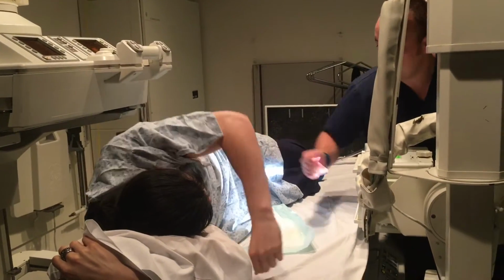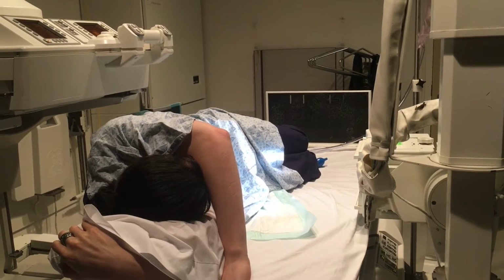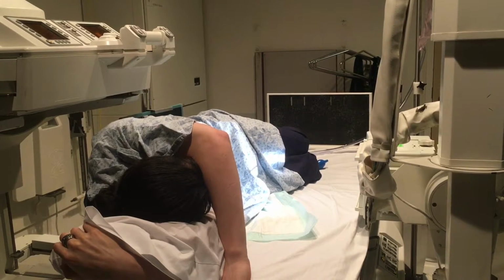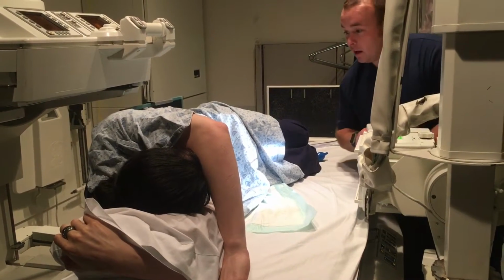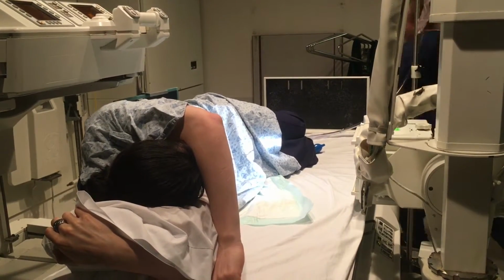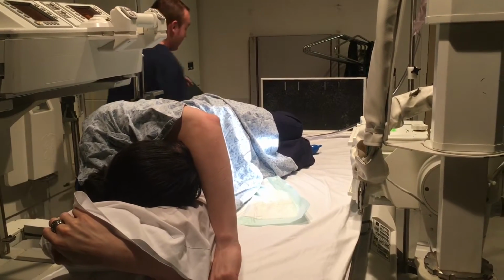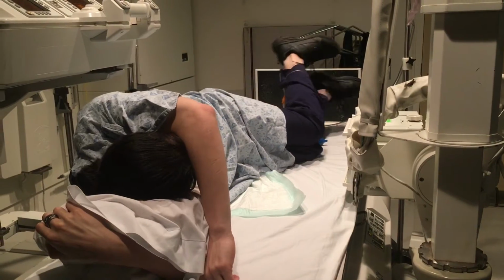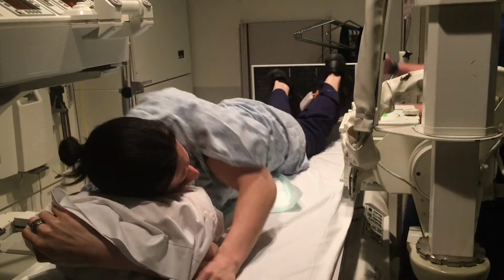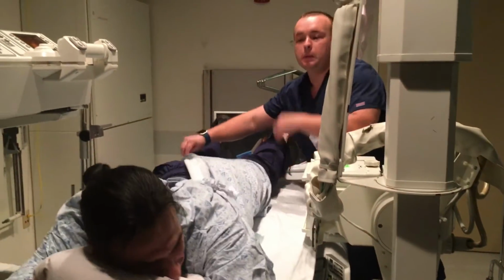Go ahead and raise this up, yep, just like that. Taking a deep breath and hold, blow out, hold, X-ray, breathe. I use the same technique as the one before. Alright. This time, go ahead and roll onto your belly. We are almost done, sir. Yep, there we go. Alright, all the way down. Yep, nice and flat. Keep your covers up.